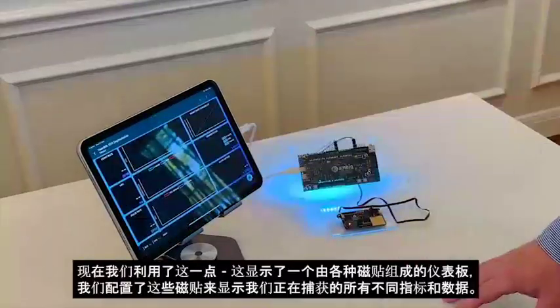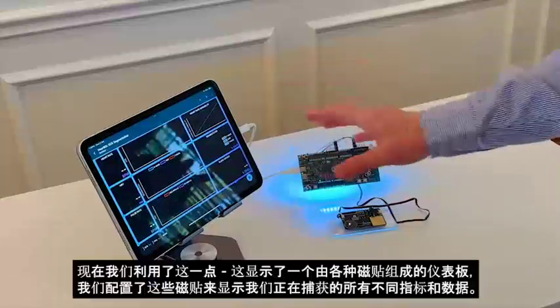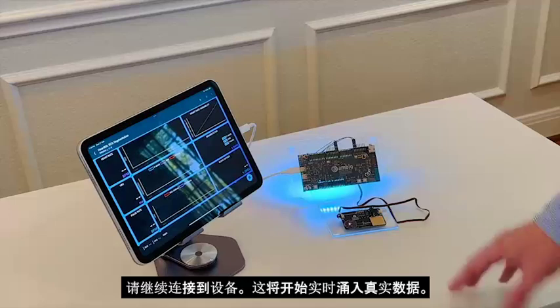Now that we tap into this, it's showing a dashboard of various tiles that we've configured to show all the different metrics and data that we're capturing. So we'll go ahead and connect to the device, and this is going to start pouring in real data in real time.